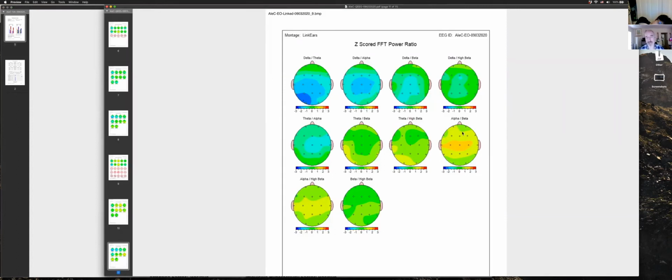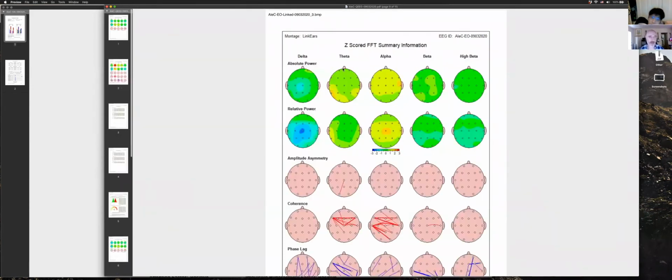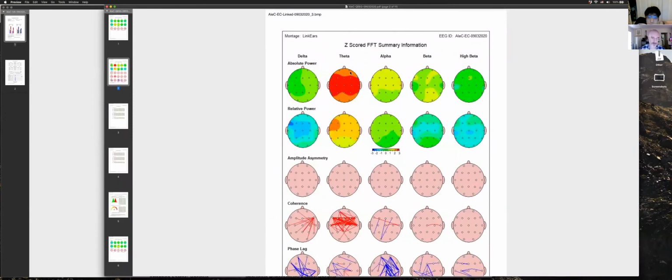And we'll exercise this down and break this up and bring up this stuff. And you'll be sleeping like a rock, hopefully. And this theta will then go away a little bit, and your mood will come up, your motivation will come up, you'll unclench the anxiety stuff, ideally.